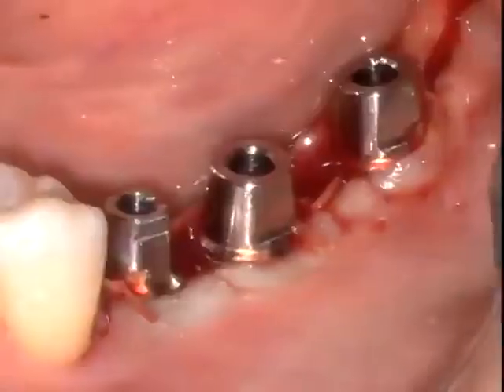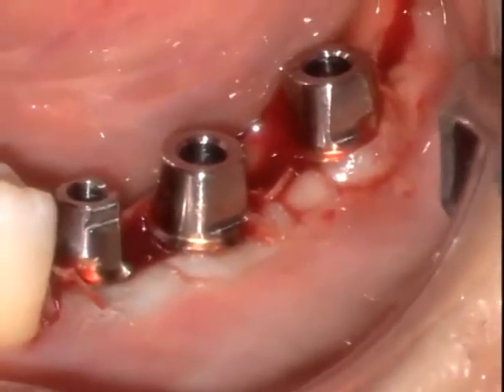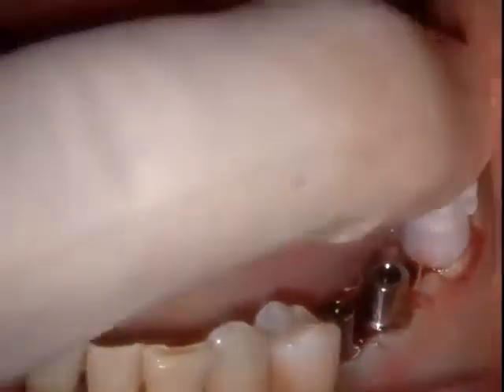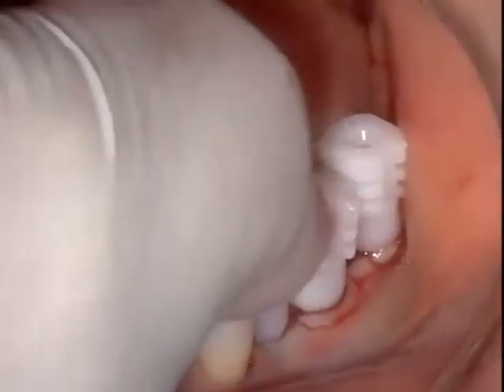We're then going to irrigate the area as you see here, and we're going to locate the keratinized tissue quite clearly here just below the chamfer or shoulder of the permanent abutments. We're then going to use a replica of the surgical guide that was painted with barium sulfate, and we're going to use that for our temporaries. And you can see we have options here.